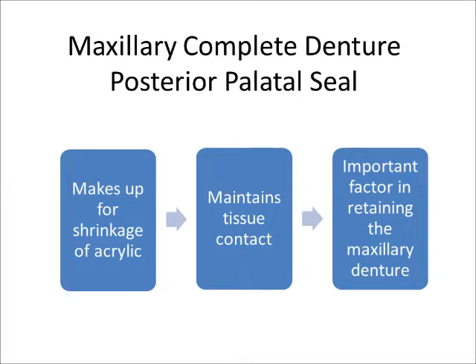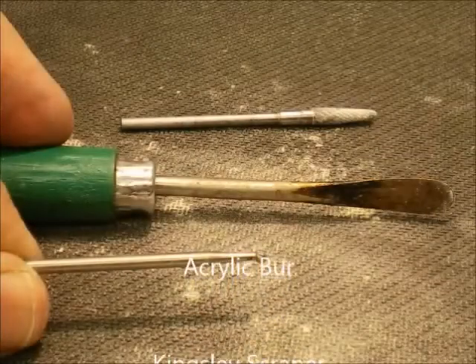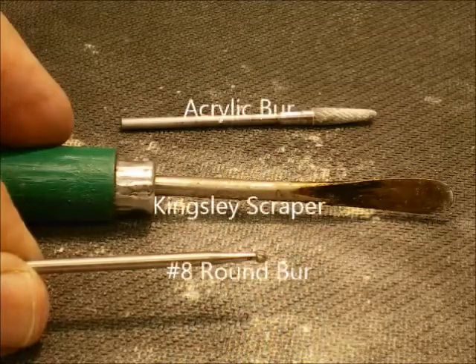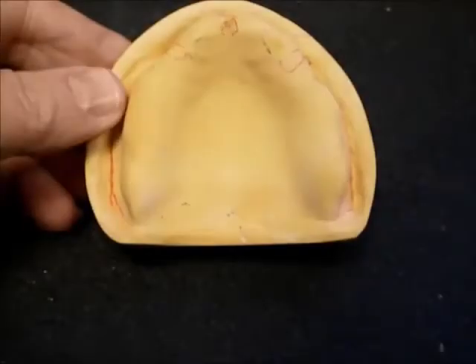The purpose of this video is to demonstrate how the posterior palatal seal area is prepared on the maxillary cast. A companion video further describes this area in greater detail. Instruments suggested for this exercise are an acrylic burr, a Kingsley scraper, and a number 8 round burr.